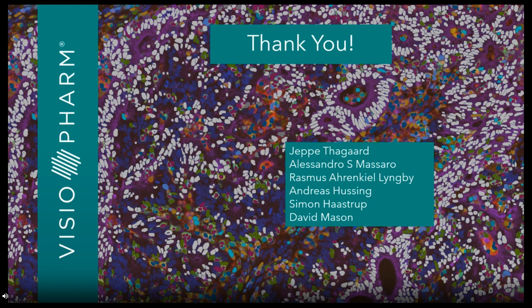Thank you, Dr. Vasaturo. The next question is, how does the antigen retrieval work? One more question for me. It's basically the classical antigen retrieval that you would perform also for chromogenic IHC, like DAB staining. The protocol that we use is fully optimized to run on the BondRx. So usually this is ER2, which means pH 9. But if you would do it manually, any of the classical antigen retrieval methods can be used.